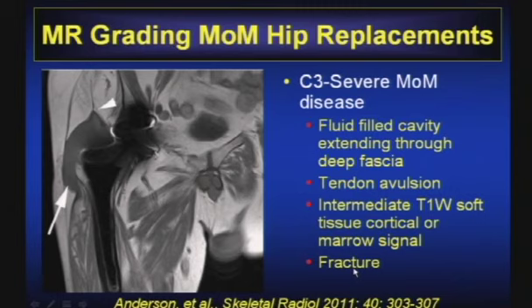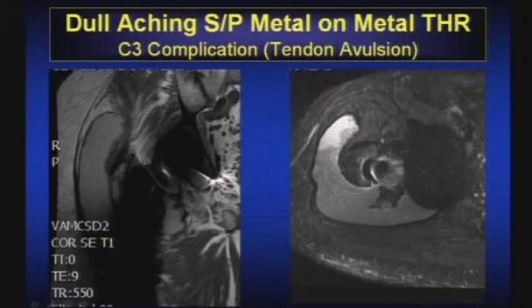Okay. If a fluid collection is identified, they're going to try to aspirate it and see if there's ions. They're following these patients' serum ion levels. This is a huge, huge deal. And I've gotten 10 or 15 emails from medical legal standpoints looking at things like this.